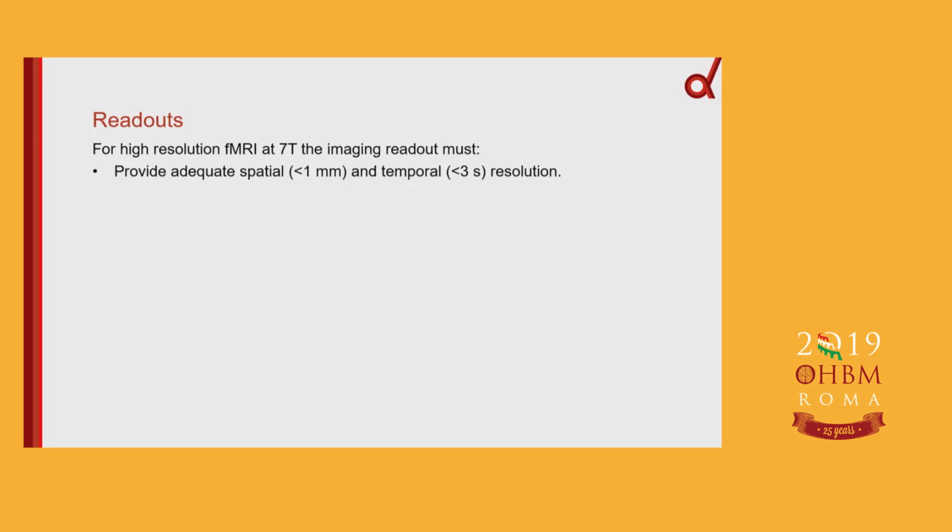We had a laminar workshop in Nijmegen about 2 years ago, and the question was, how long is a piece of string? And the answer is shorter than 1 millimeter, right? So people generally agreed if you want to be in the game for doing laminar, you need to have something better than 1 millimeter. And that's a bit of a relative number.